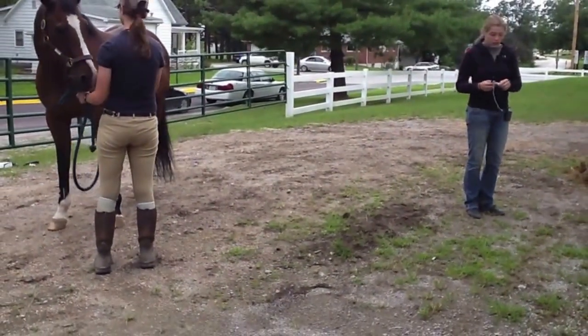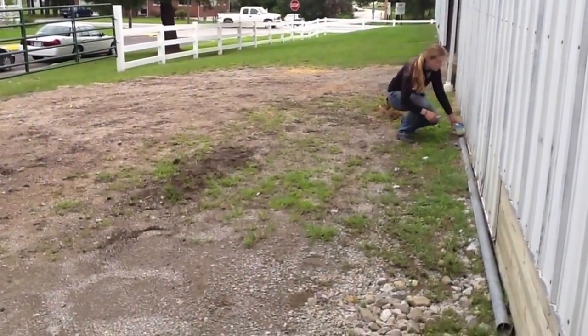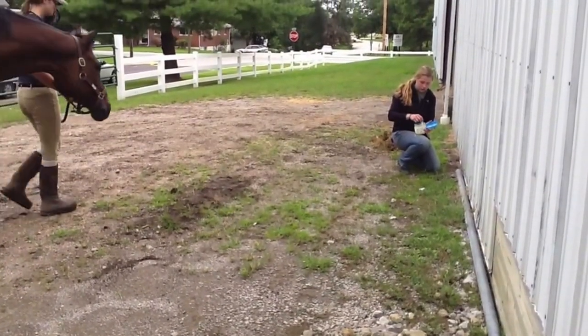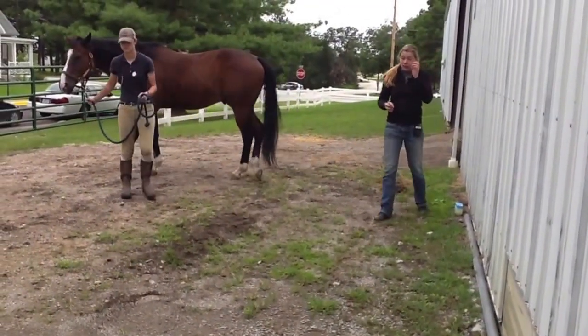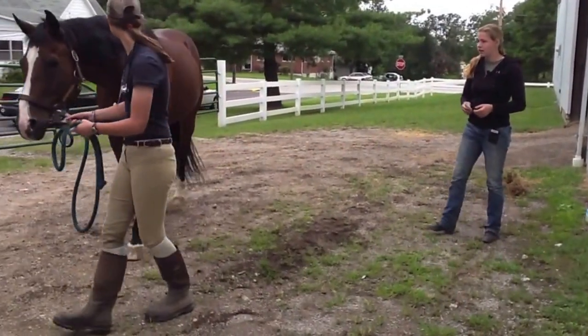For this video, I'm going to use a digital thermometer. And when using any kind of thermometer, mercury or digital, you want to make sure you insert it into some petroleum jelly or Vaseline. This lubricates the thermometer and makes it easier to get inside. Thanks, Katie.